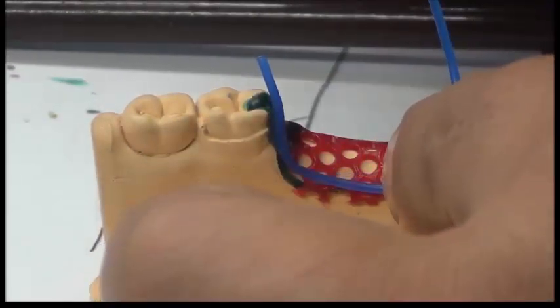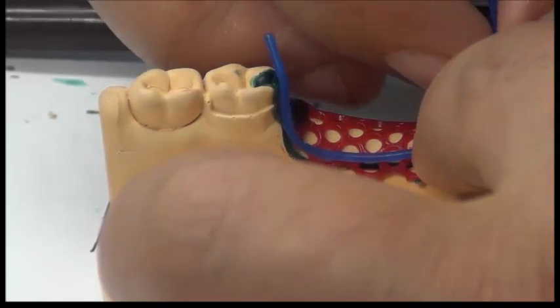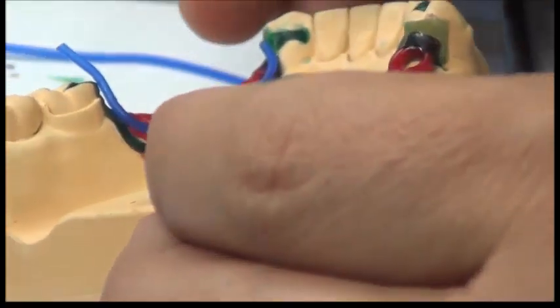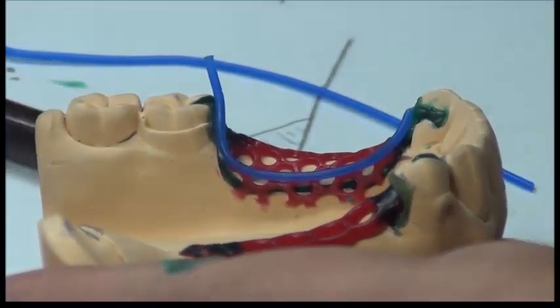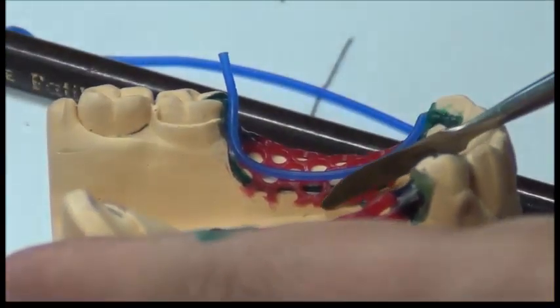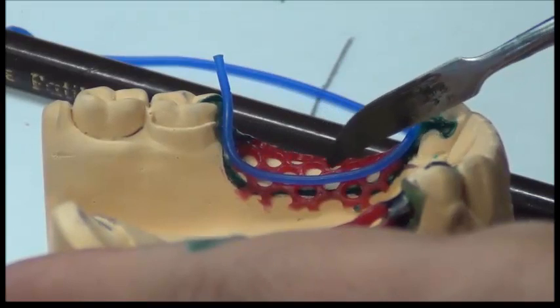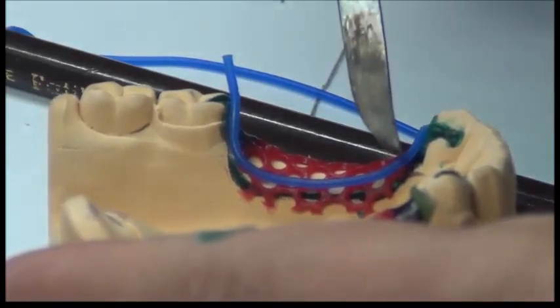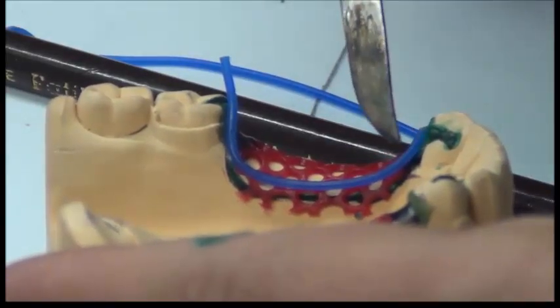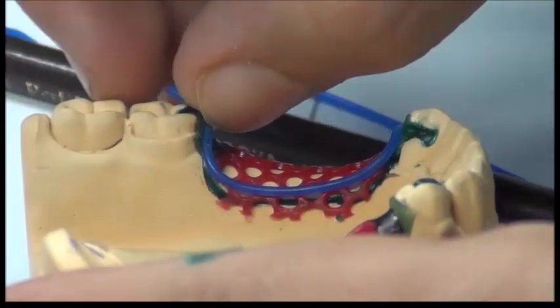Now going to the canine area, I'm going to add in and remove the excess. So it's like a rectangle. If I look at it closely once more, this is the internal finish line down here. Okay? This is the width of the teeth that I need for the teeth to be added. So it's in between the marginal gingiva of the teeth and the internal finish line. And it runs vertically to meet the guide plate from the lingual side of both sides. Okay? This is easy for the bounded saddle. It's similar to the upper.